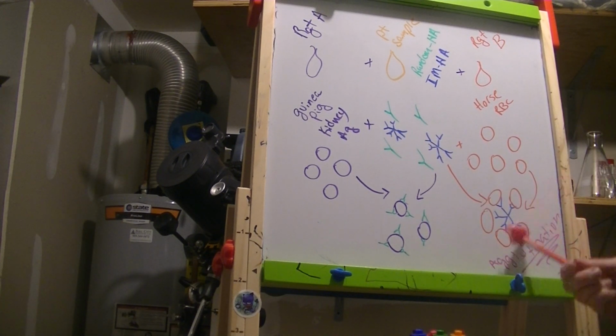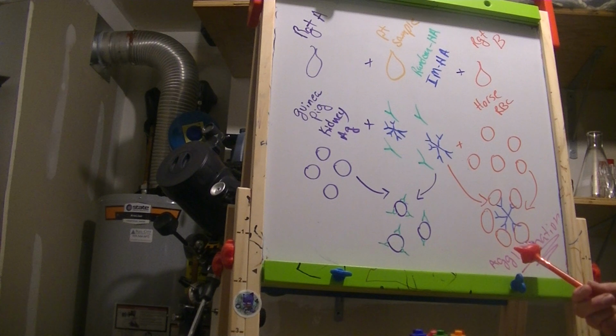Please use this as your explanation of principle for your study guide for the mononucleosis test, color slide 2, mononucleosis.